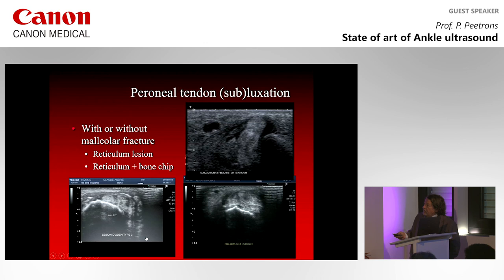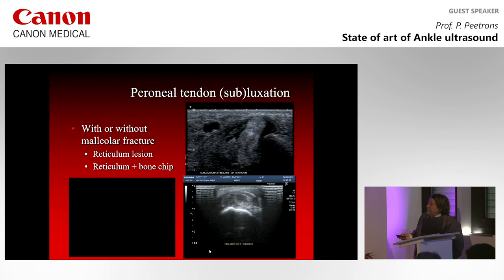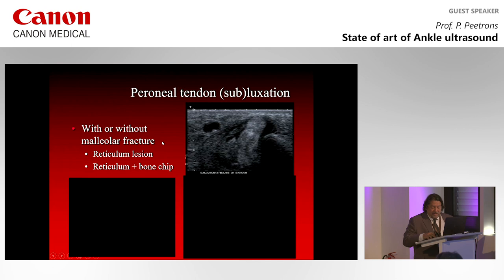It is a fracture. It is a bone chip coming from the fibula, and the retinaculum of the peroneal tendons is just avulsed from the tip of the fibula. This is another example where you can see this little fracture of the fibula, and the peroneus tendons are going in between the fracture and the fibula. So this is a very important lesion. This must be treated with more than a simple band over the ankle, because this is a cause of recurrent lesions, recurrent dislocation of the peroneus tendon.